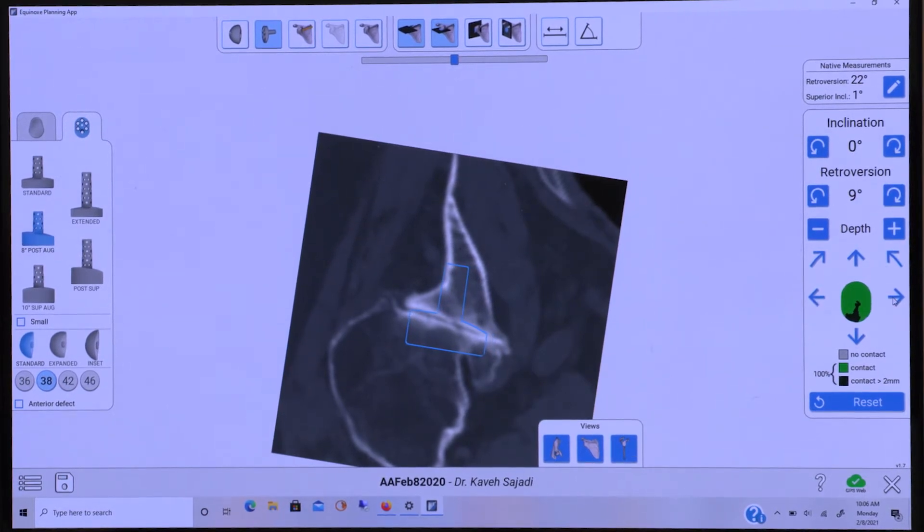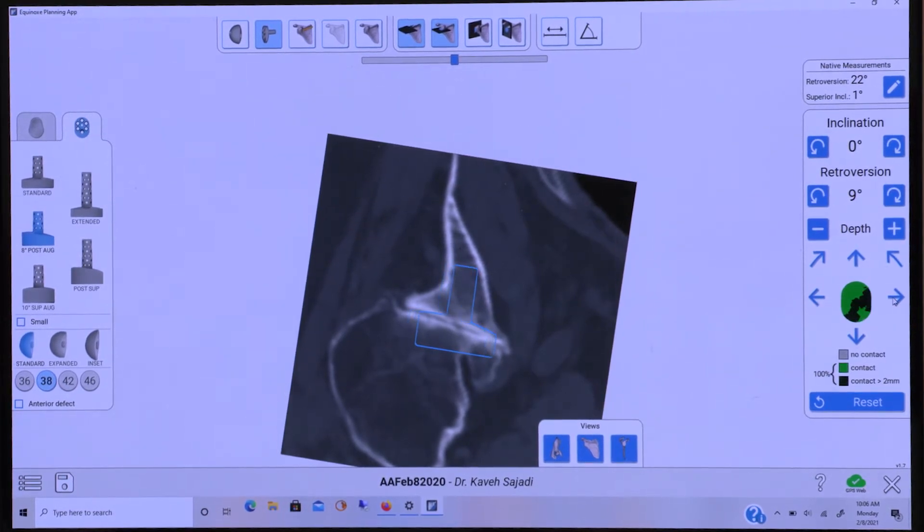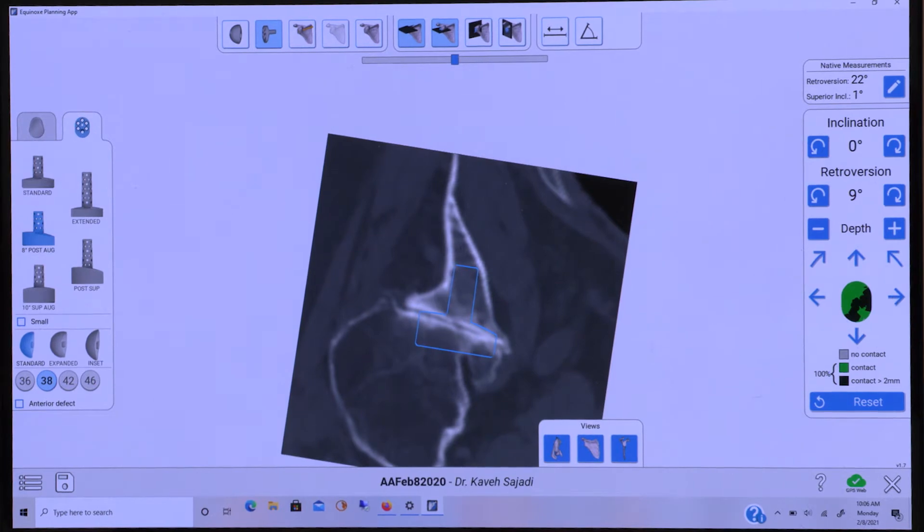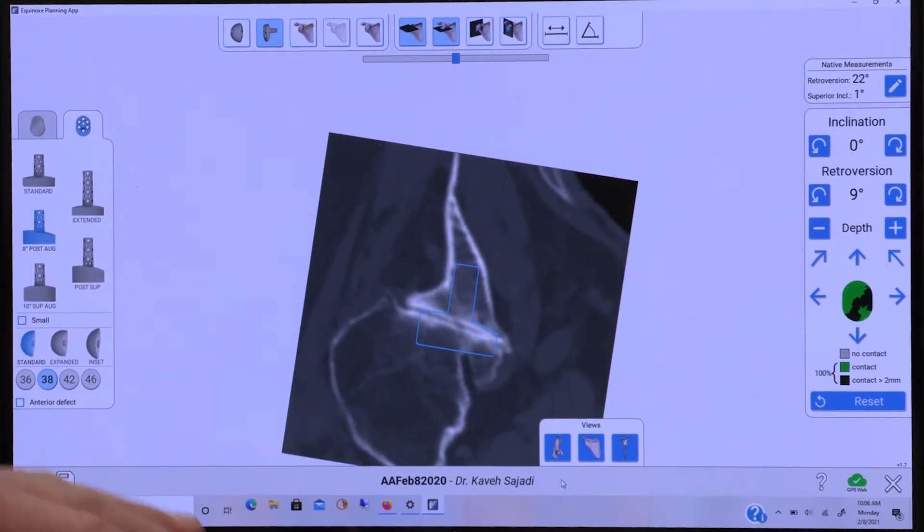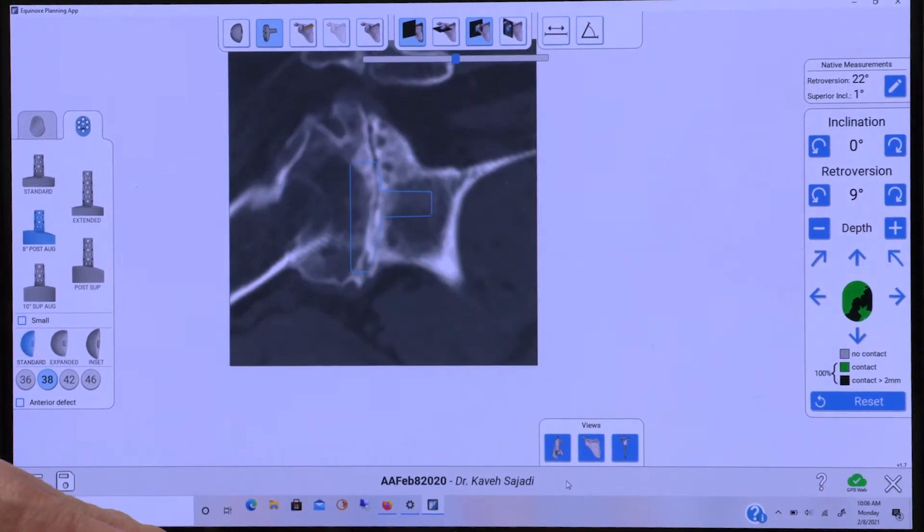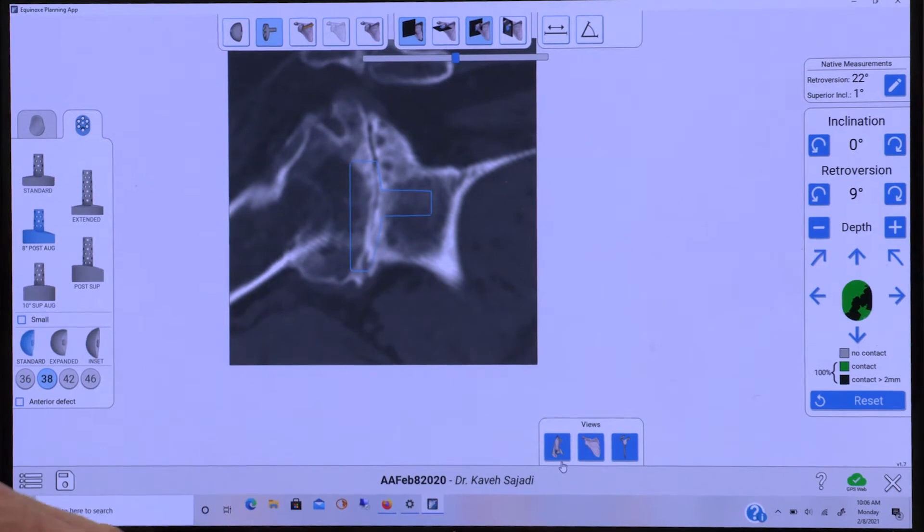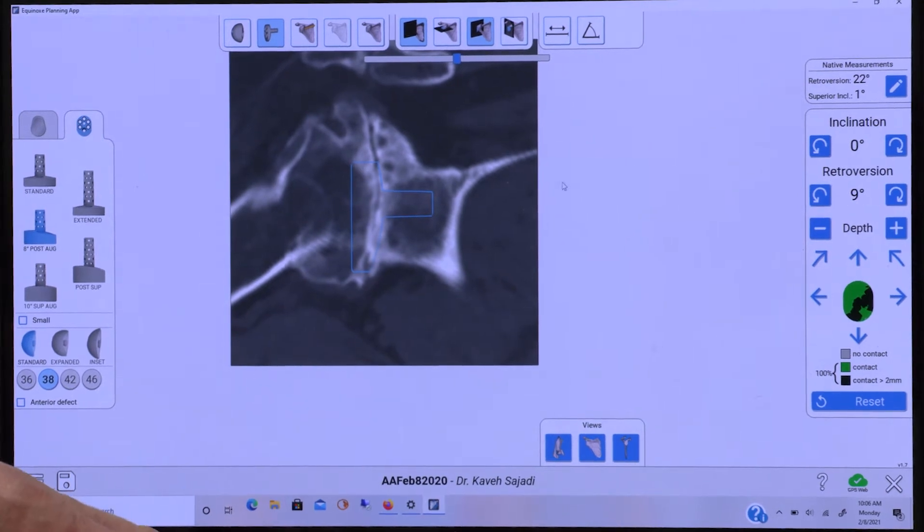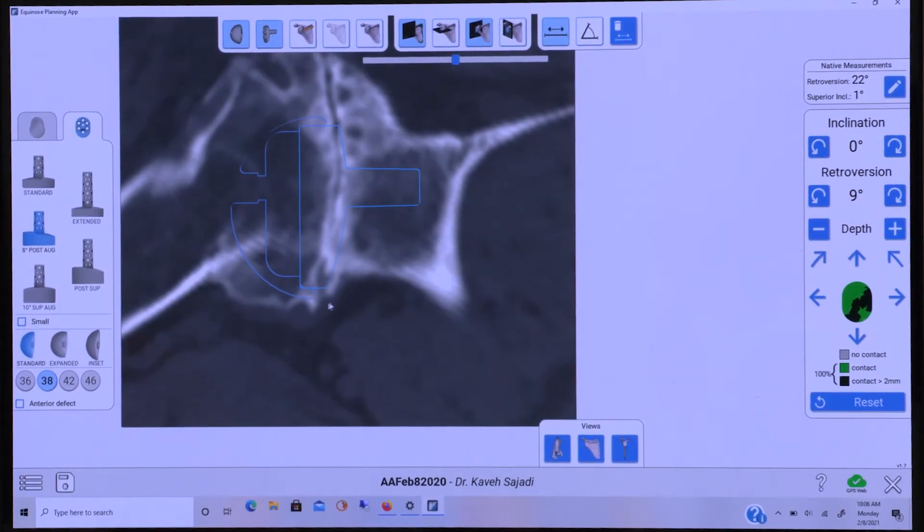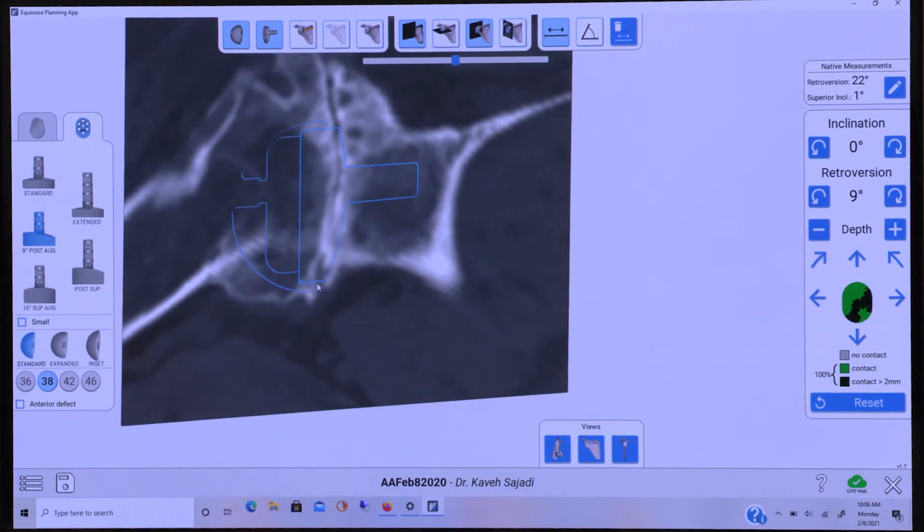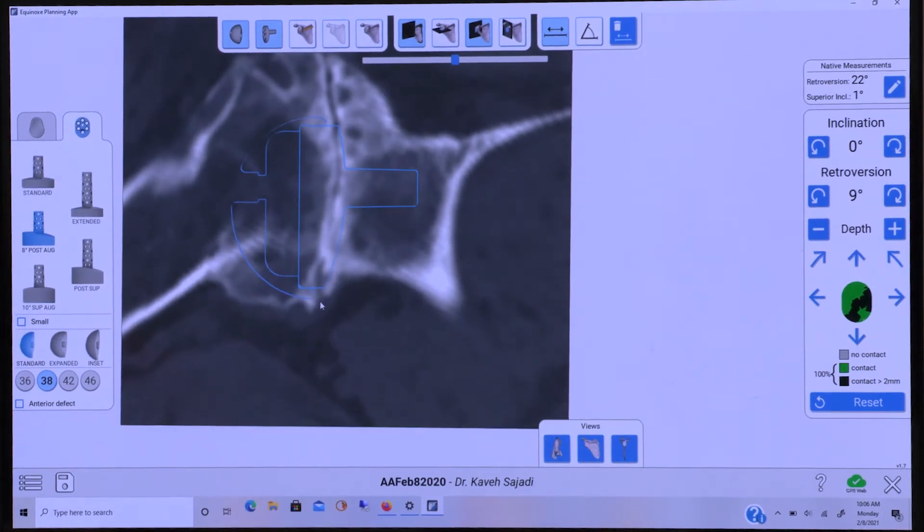Simple position changes of the base plate can be trialed before final position is determined. Inferior overhang can also be appreciated and measured in this case of approximately 5 millimeters using the software available.